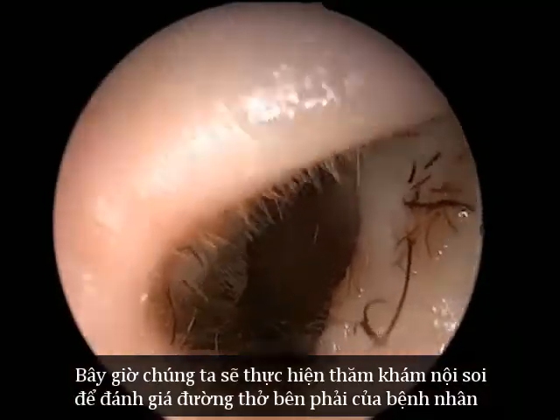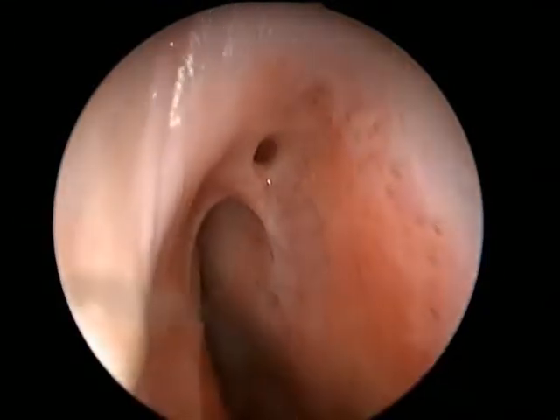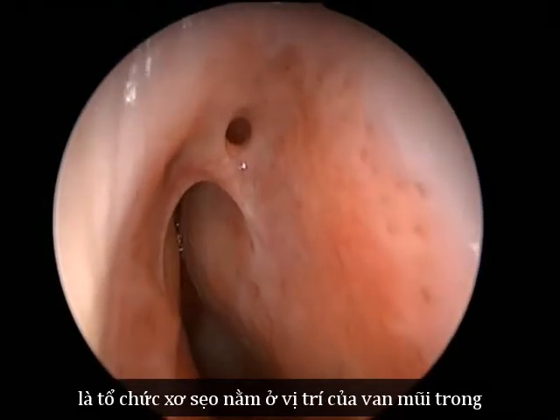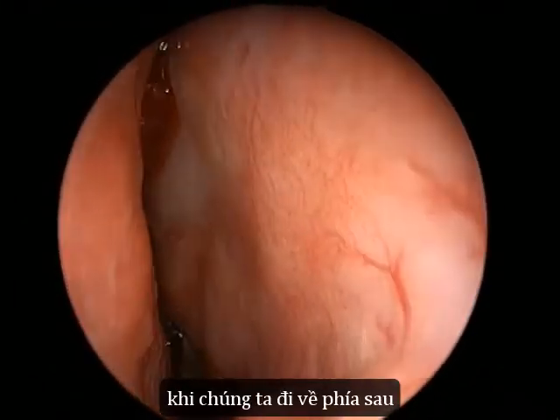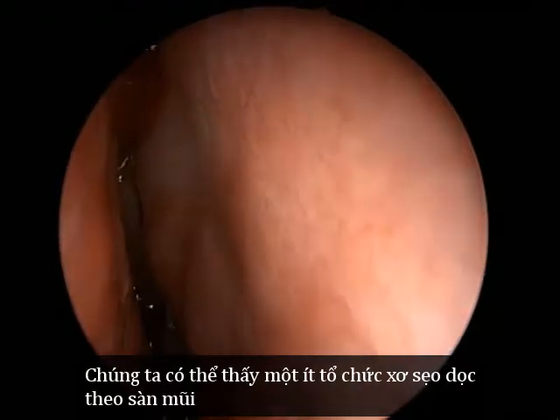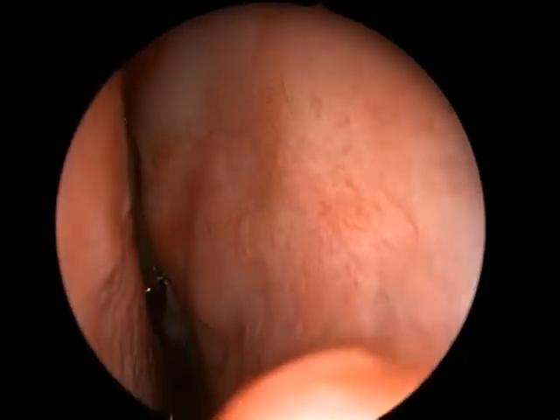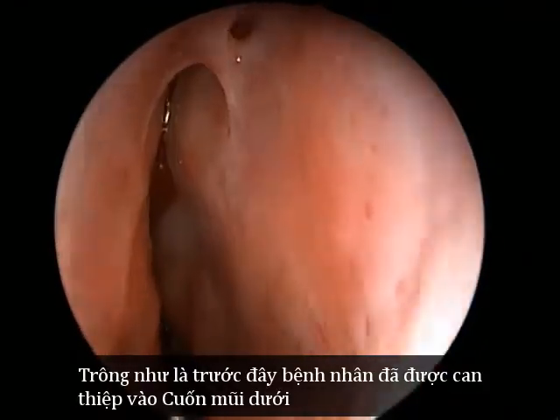Okay, so now we're going to perform an endoscopic examination. We're going into the right nasal airway. You can see that there's a scar located in the region of the right internal nasal valve. As we move posteriorly, you can see some scarring along the floor of the nose, but otherwise the airway looks reasonable. Looks like there's been some previous work on the inferior turbinate.